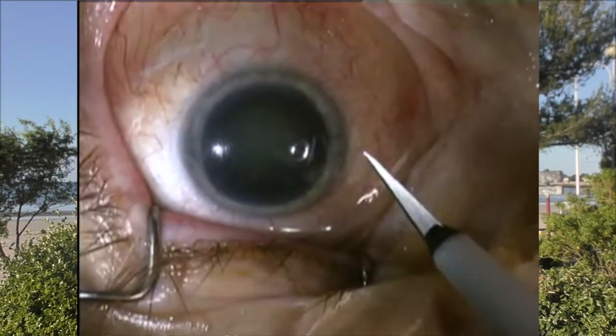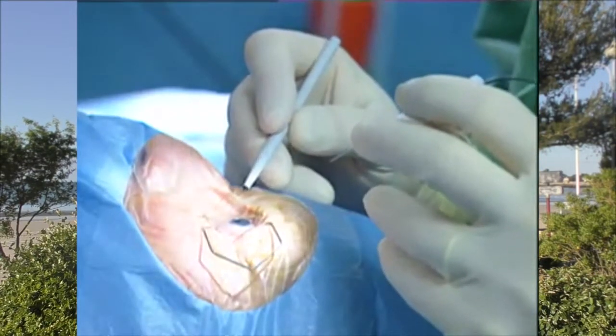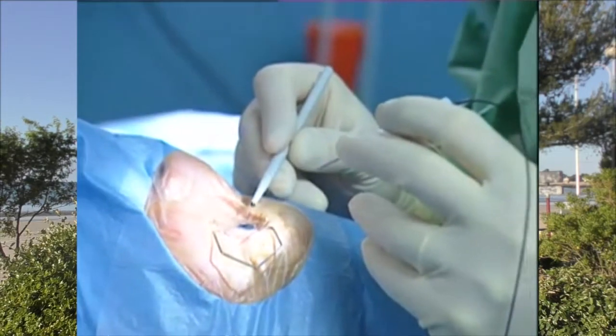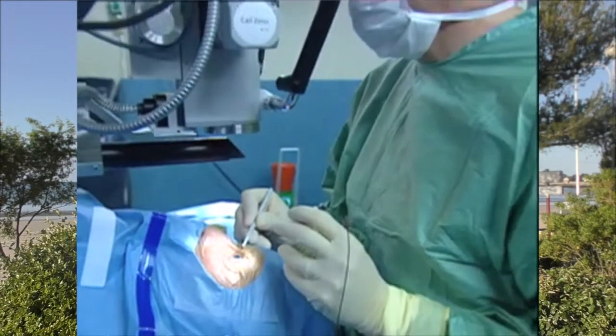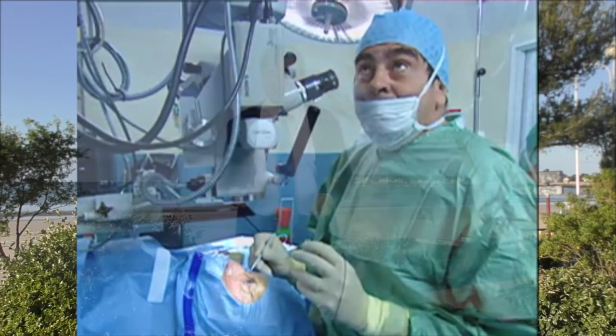First, the surgeon's left hand — if he is right-handed — is free. Which cataract operator would be willing to sacrifice his left hand to hold the fiber illuminating his surgical field? He naturally considers his microscope as a combined visualization and illumination system to practice bimanual surgery, just as you hold your fork and knife after turning on the kitchen ceiling light.